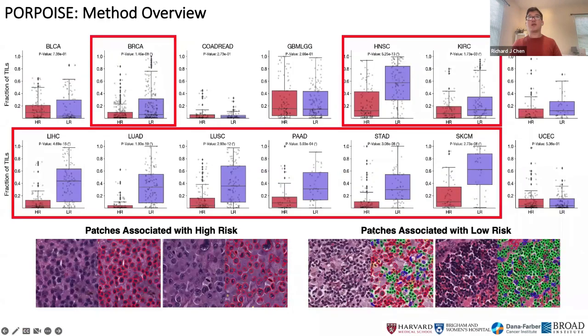And the main thing I think our work found that was quite interesting is that we hypothesized that, for cancer prognosis, this method could elucidate tumor immune co-localization in driving predictions for favorable prognosis.